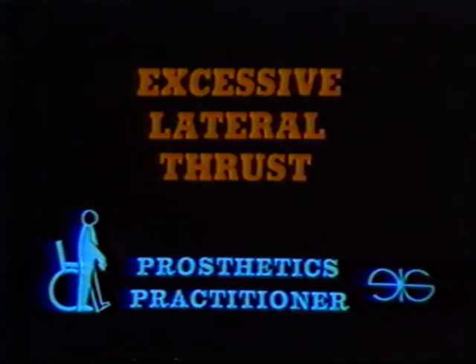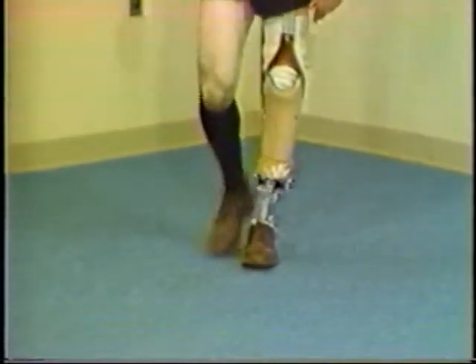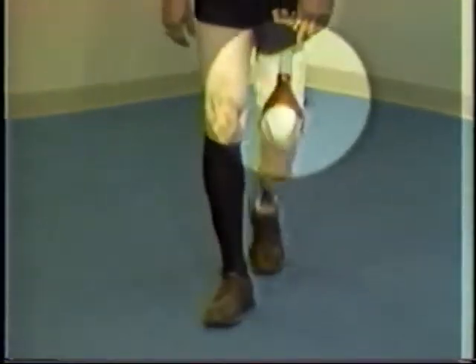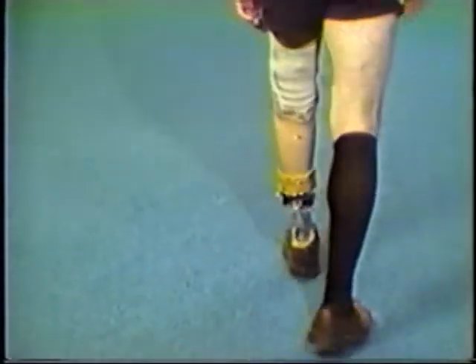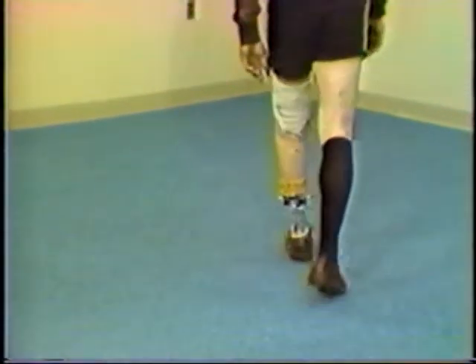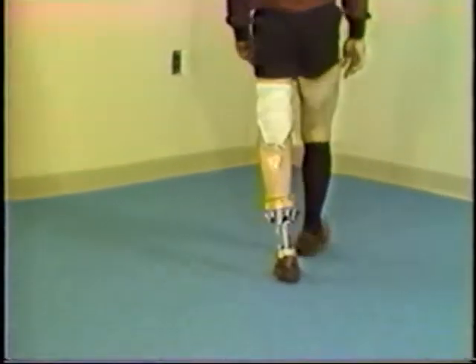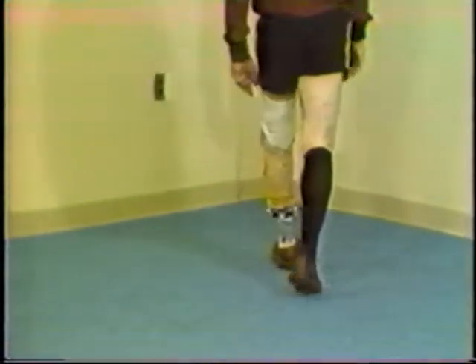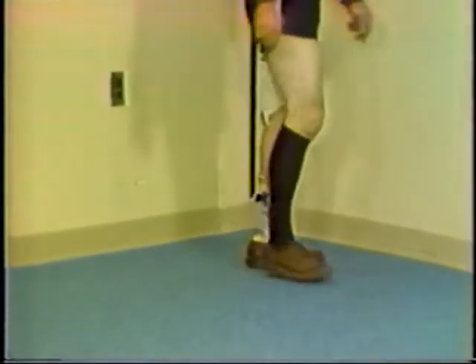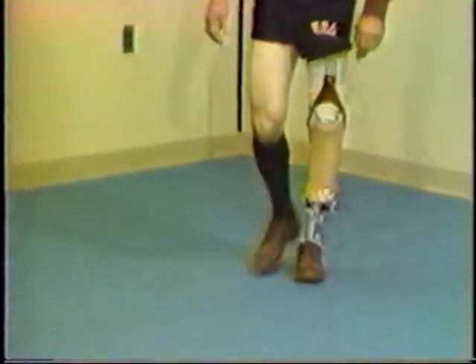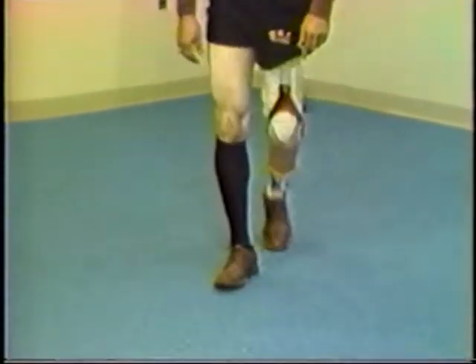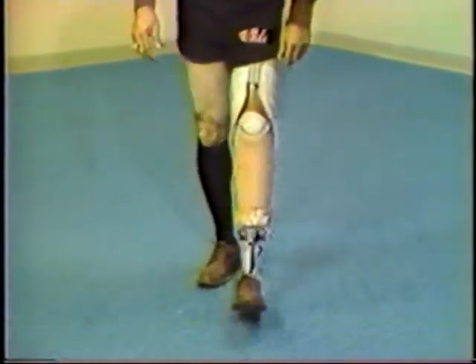A second deviation you may observe is excessive lateral thrust. If the lateral thrust is too great, the knee will be forced in a lateral direction. Watch the knee carefully as we demonstrate excessive lateral thrust. This situation can be caused by the foot being too far inset. It is also possible that the socket ML may be too large, causing the knee to be unstable. The amputee may report too much pressure on the medial side of the knee with excessive lateral thrust.